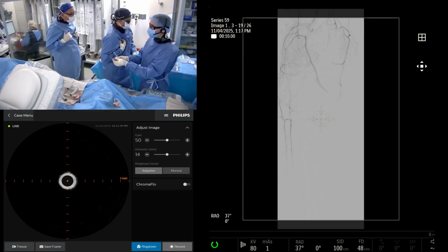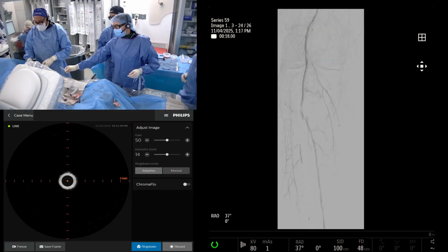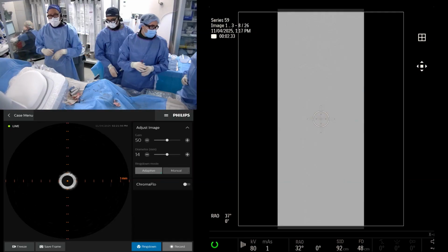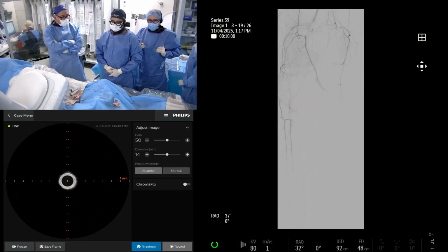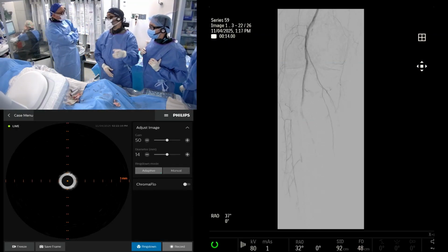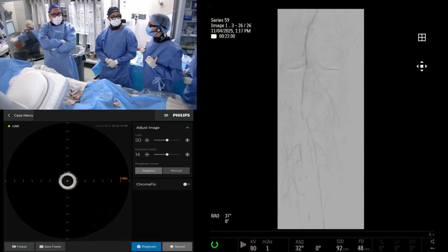Let's try an ACT. I have the ACT for you, sir. So you would just run the Penumbra down the hole. Probably going to get something out. Yeah, always get something. I think it's just recoil. I think it's just dissection. I think the whole thing is just falling off. But I think there's also a filling defect down there, so I think it's reasonable.